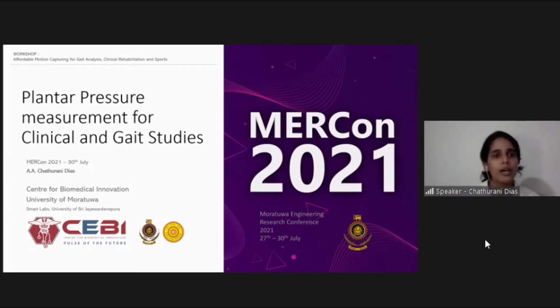So in this session, we are going to speak more about a particular parameter, the plantar pressure, or else the foot pressure, that is, the mechanical pressure felt by the sole of the foot due to the load exerted on it, and how we can use this parameter in different clinical and gait studies.